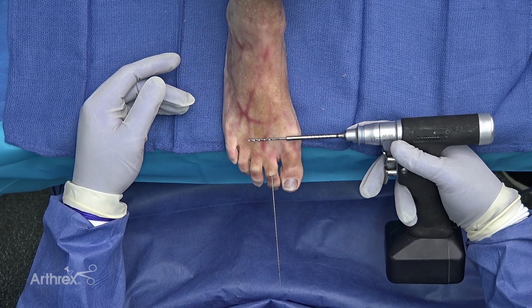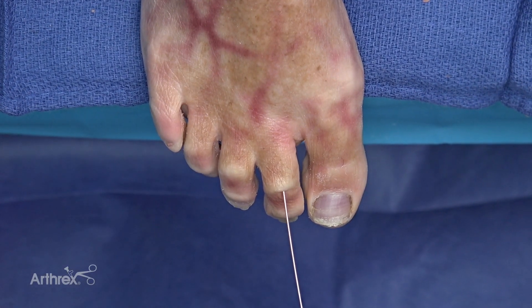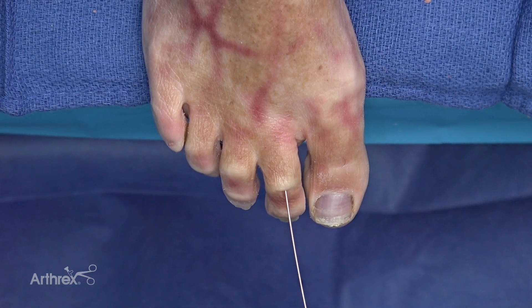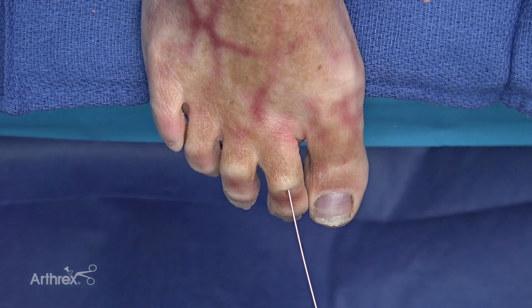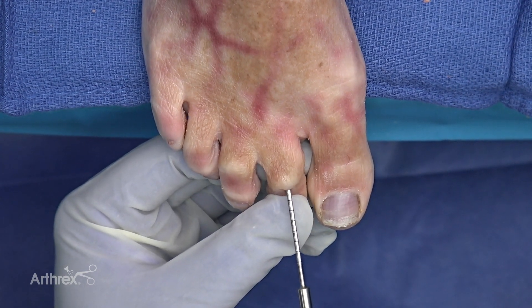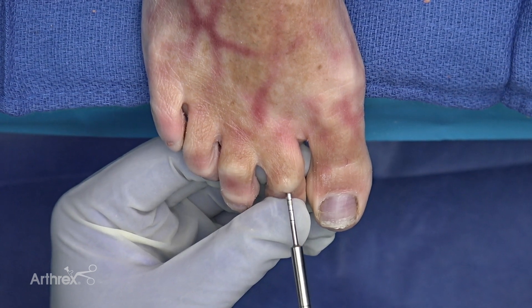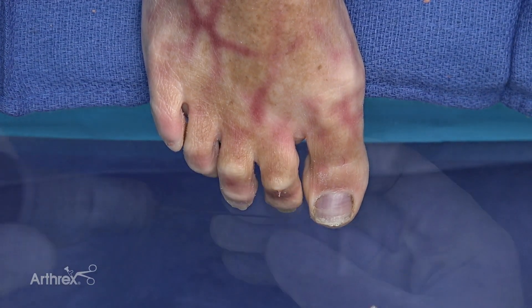Next we're going to use the 2.0 millimeter cannulated drill that prepares the intramedullary canal for the 2.5 millimeter compression FT screw. The positive stop will be my proximal cortex of the proximal phalanx. You could drill through, so you do need to use some care in doing this.